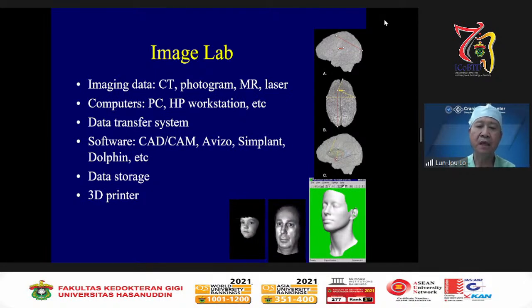This is the case with 3D imaging, and you can simulate accurate landmarks and also structural deviation, the differences, overlapping A and B, and measurement simulation shown using the color map, and also use the 3D laser image.